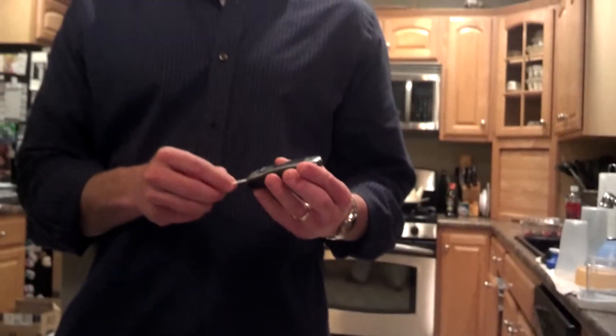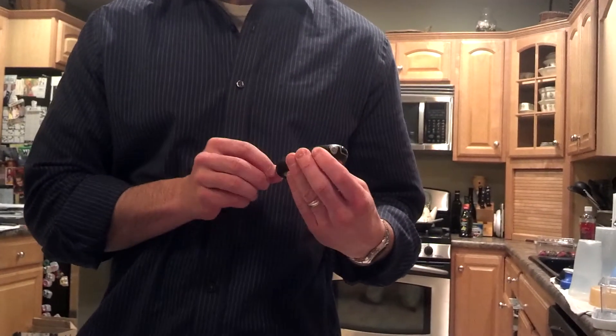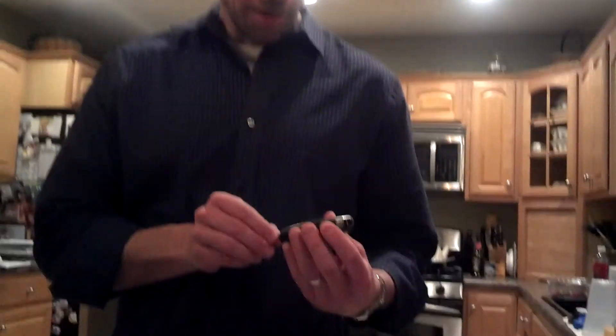I'm going to hold this against my finger and just prick it. First things first, we're going to stick this in the machine. It says code 643, and that's what's on the container. So we're ready to go now.